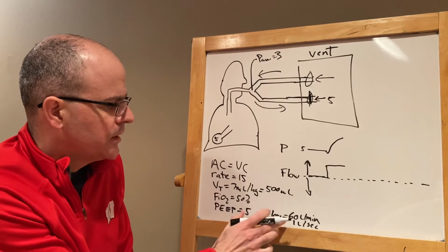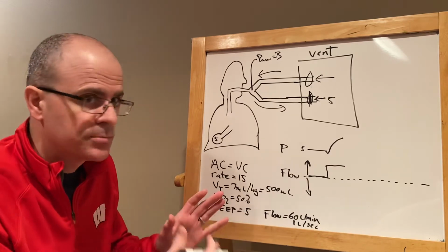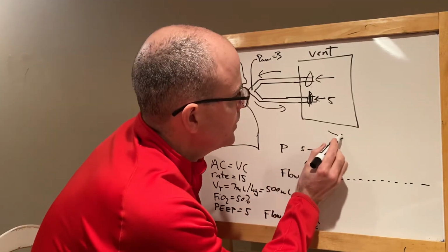Now, if you tell the ventilator to give 500 mLs at a rate of 1 liter per second, I think you can appreciate, again, that would be half a second. So inspiration is going to take half a second. Let's think about what's happening right before it finishes, right about that time.